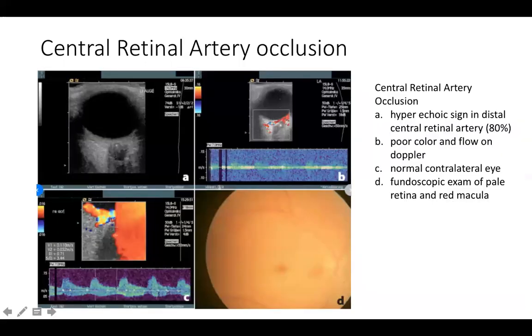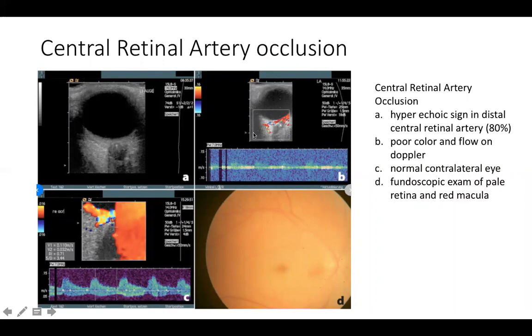Next we can look at central retinal artery occlusion for painless loss of vision. With this, you're looking for a hyperechoic signal in the distal central retinal artery, near the area of where the optic nerve would be. If you put color flow in this area using color or spectral Doppler, you'll see minimal flow and you won't get the same peaks as in a normal eye. You can look at the contralateral eye to compare — in a normal eye you'll see normal amplitude peaks, which are absent in central retinal artery occlusion due to decreased flow. Fundoscopic exam can also help make that diagnosis.